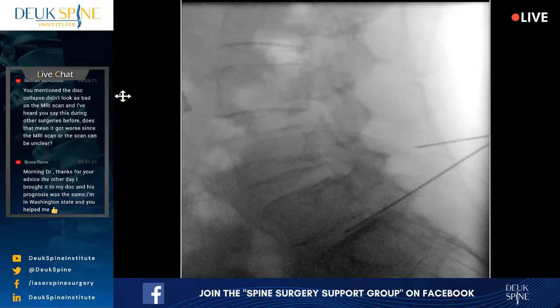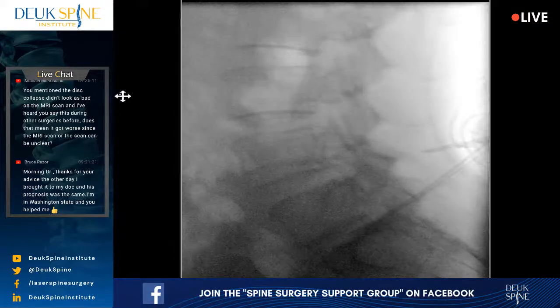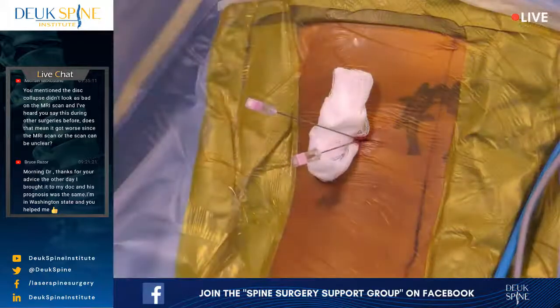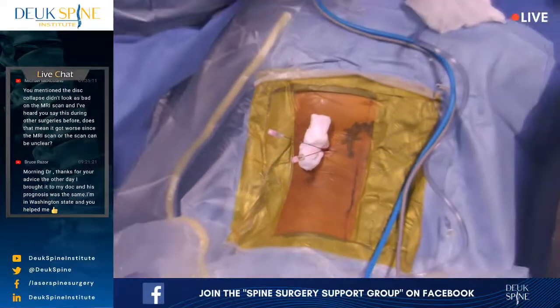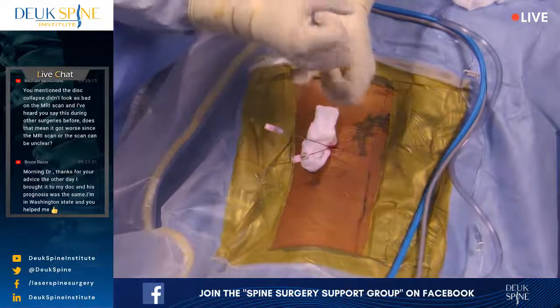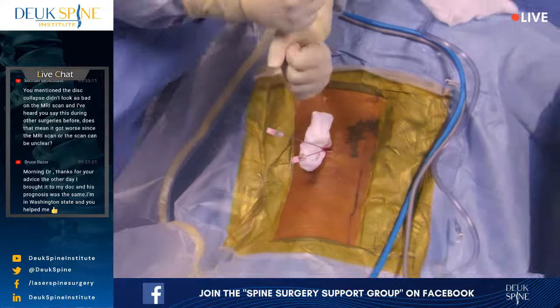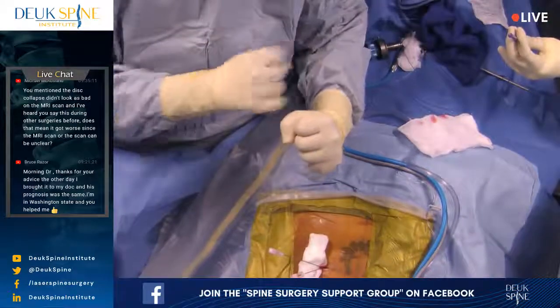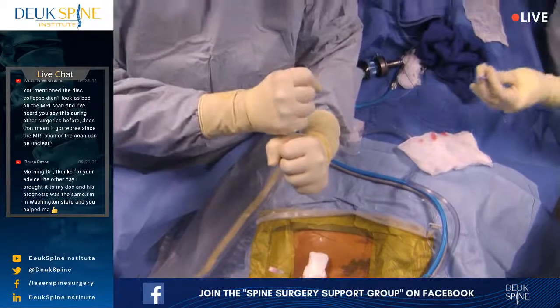Diego, let's turn the light back on for a moment. And can you see my hands? Yes, I can see your hands. Jordan, come on. Come on. I think you got a wag issue. Diego, you see my hands here? I do. All right, so this is one vertebrae. Here's the other vertebrae. And we're going for the disc or cushion between.